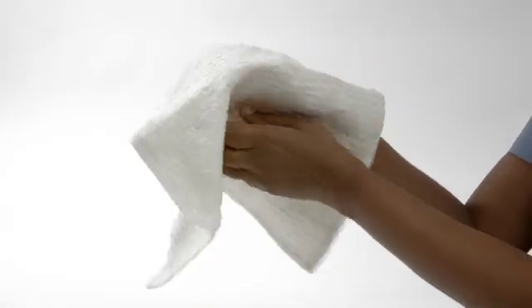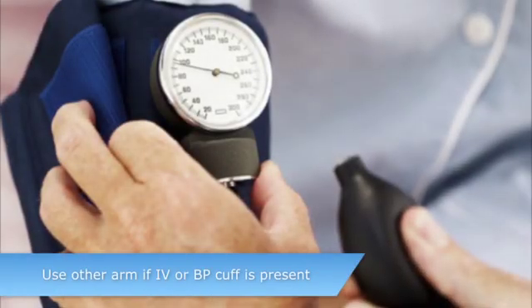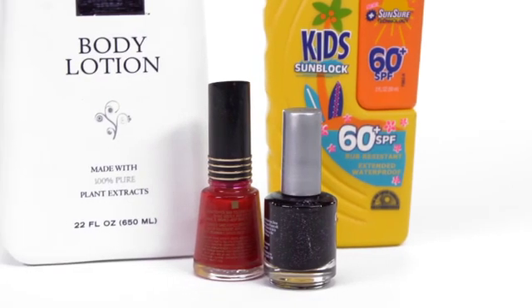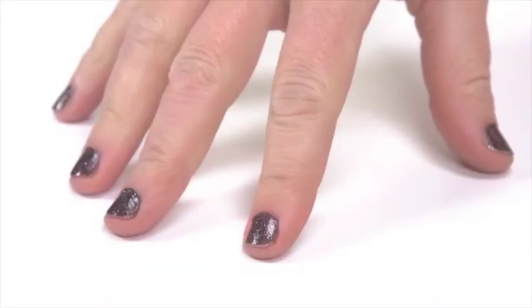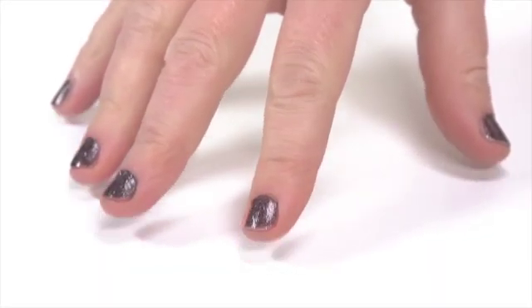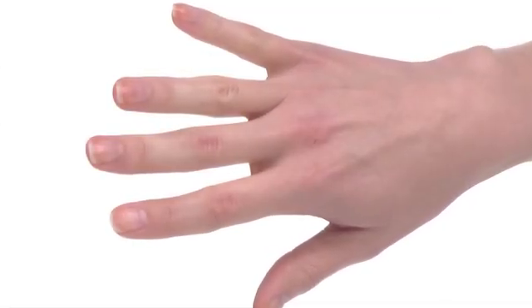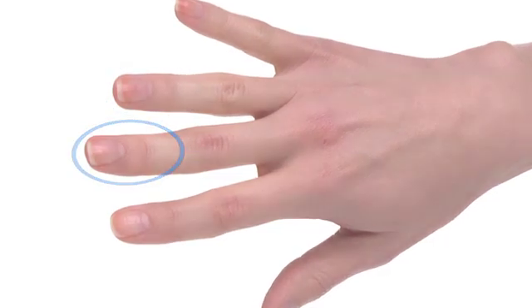Wash and dry the hand where the sensor will be placed. Do not use on an arm with IV lines or a blood pressure cuff. Heavy lotions, sunscreens, oils, dirt, and fingernail polish or artificial nails may alter the accuracy of the sensor. So start with a clean dry finger. The sensor may be placed on the index, ring, or middle finger.